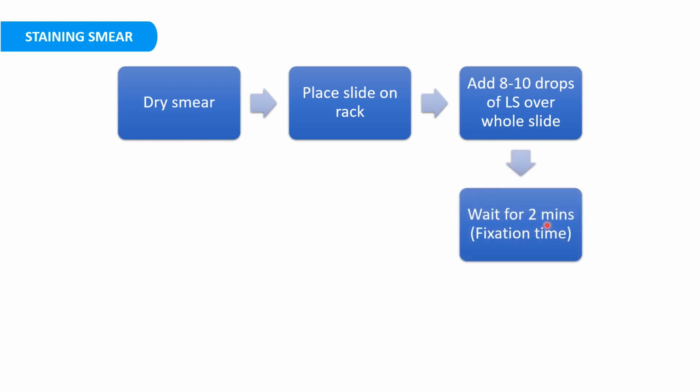Then wait for 2 minutes. After adding Leishman stain, we have to wait for 2 minutes. This 2 minutes time is known as fixation time. It is not the staining time. Here the methyl alcohol will fix the smear on the glass slide, but no staining will happen. So this waiting of 2 minutes is the fixation time.